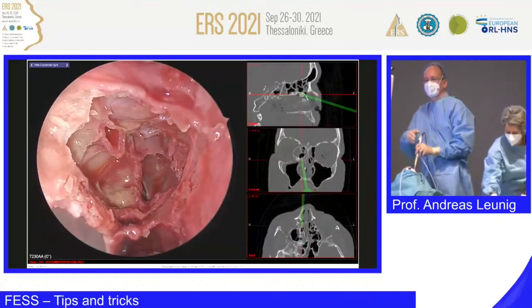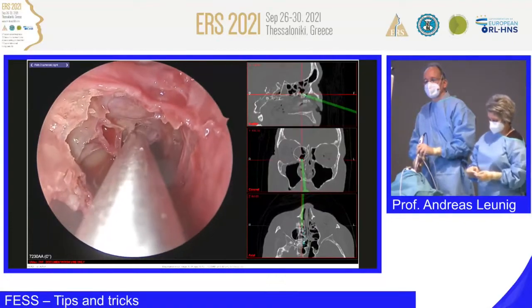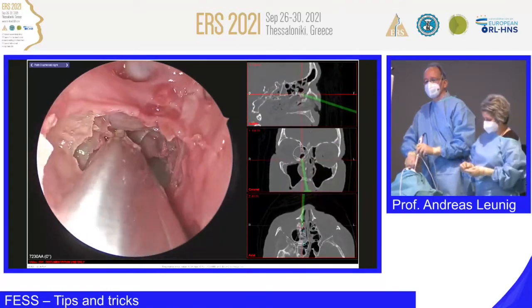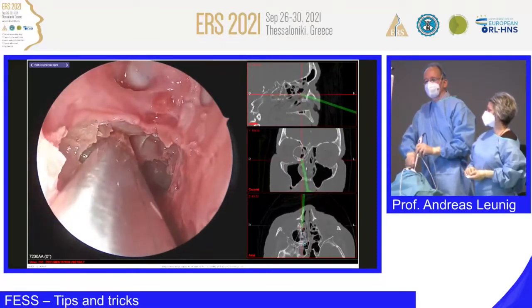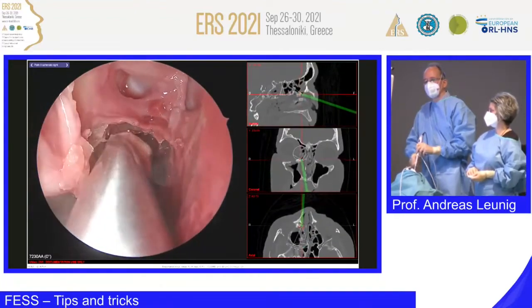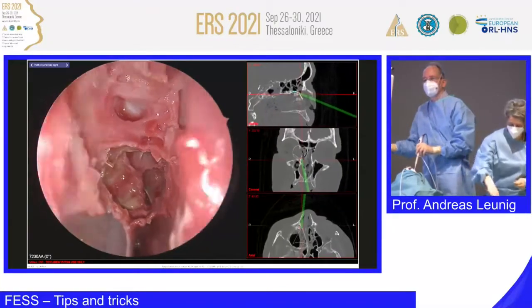Elegant punch again. So we still have a part of cells here in the ethmoid cavity, which we can resect. I go there. I take this all away, coming from back to front. Okay, there's still a part. Navigation, we will have a look.